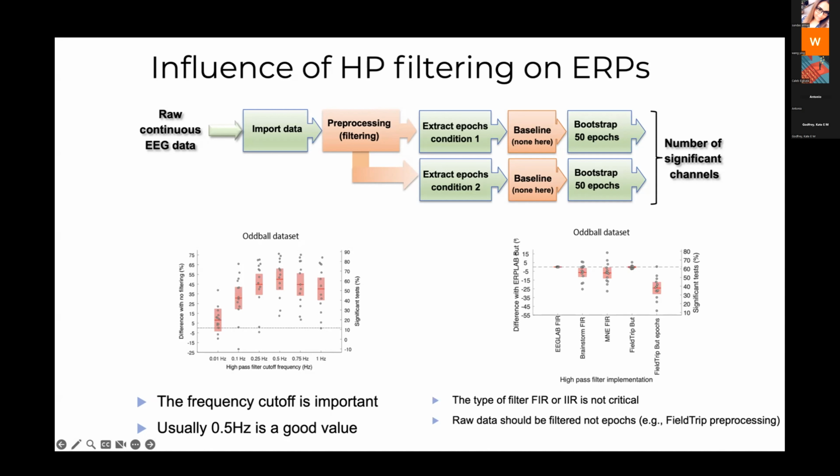The reason this is the reference is that it's the only filter that can reliably filter at 0.01 hertz. But you see these ones do very, very similarly, even though one is a linear filter and the others are not.